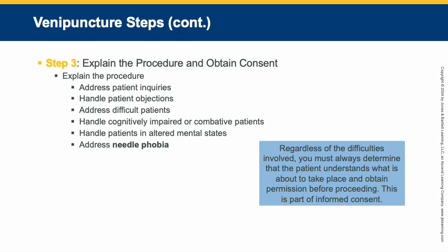So consent for specimen collection in this case may need to be obtained again from the authorized relative or guardian of that patient. In addition, patients who have drug addictions can have scarring of the skin and veins that makes finding and palpating their veins difficult. So assistance with these patients is required for the safety of everybody involved. Others nearby also could be at risk. In addition, certain liabilities may be associated with dealing with these kinds of patients. So you're going to consult the facility protocol for guidance. The facility protocol is whatever your hospital states.